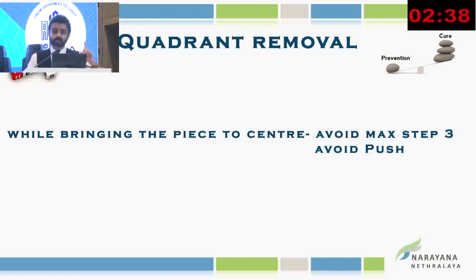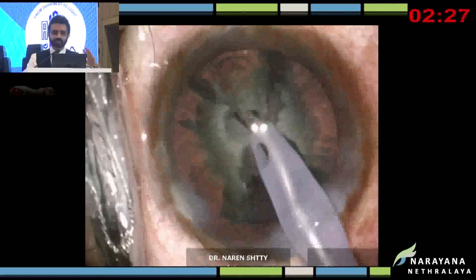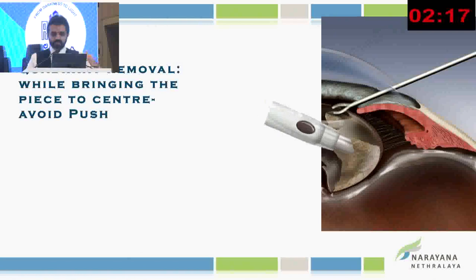The next thing is avoid to push the lens when you're trying to press 3 and 2 and hold it. What does that mean is, see, do not do this, where you push it like this and then press step 3 and 2. This will 100% lead to a PCR. Rather, just touch the lens and then press 3-2, the piece will come to you, okay? Do not push it. Please remember this. Why you should not push it is because if you push it, the phaco tip is extremely close to the posterior capsule, and when you press 3-2, immediately there's a PCR and you had it. So remember this small tip.